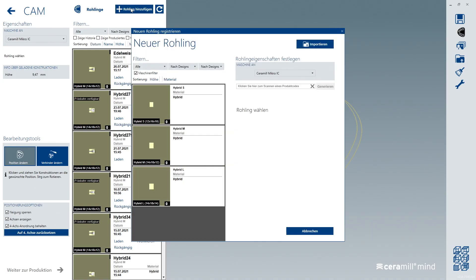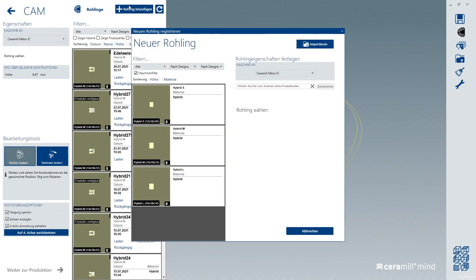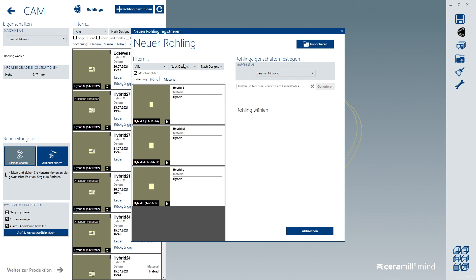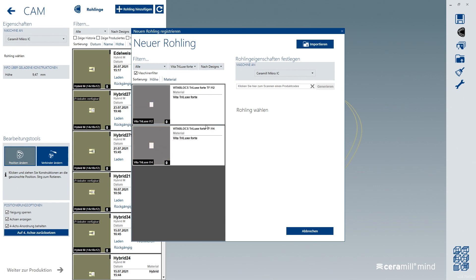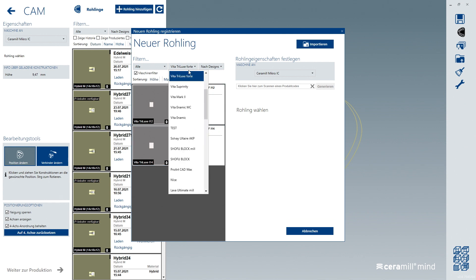A great simplification of the Edelweiss block is the possibility to machine it with a wide variety of milling programs. Whether they are used as material hybrid, Trilux Forte, or Enemic by Vita, they achieve perfect results.